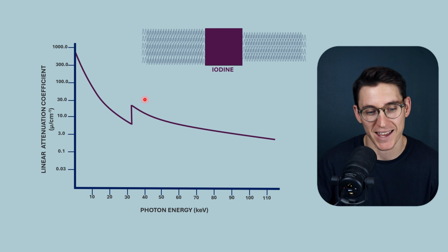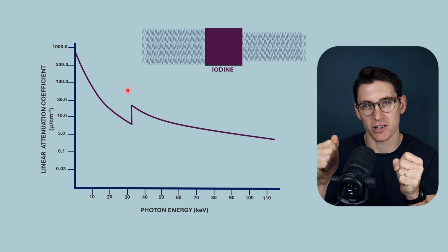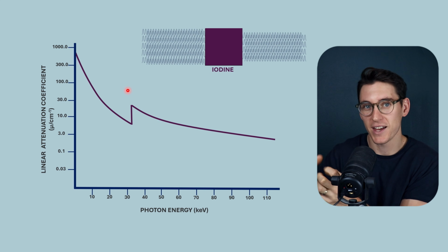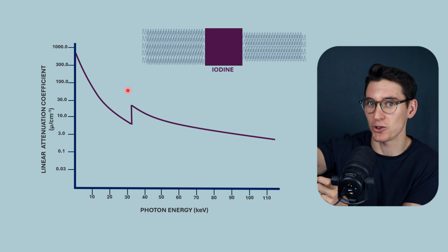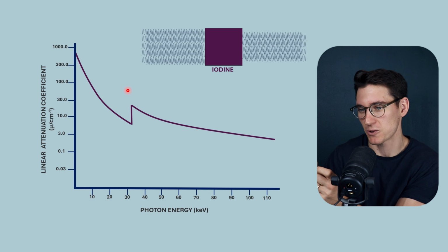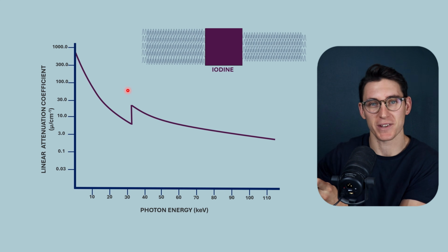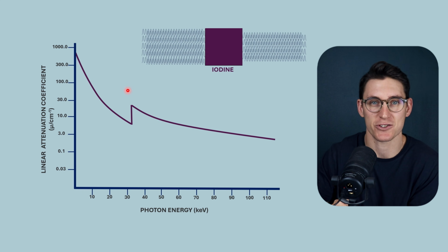Now, if you've done my X-ray physics course, you'll notice what this is. This is what's known as the K-edge. We know that for the photoelectric effect to occur, an electron has to be ejected from the atom that the X-ray strikes. That's a photoelectron that's giving dose into the tissues, if you remember from our previous talk. We've ionized that atom. In order to ionize the atom, the incident photon energy needs to be higher than the binding energy of that electron.